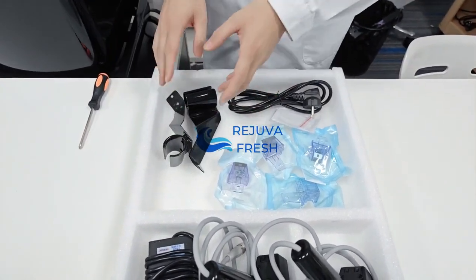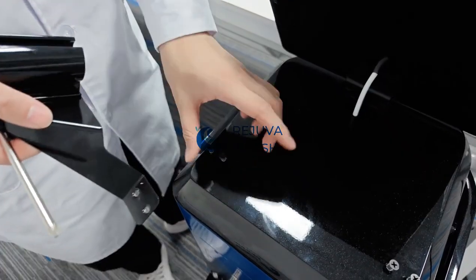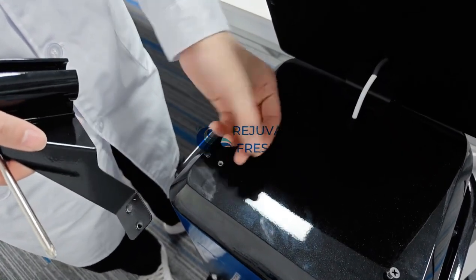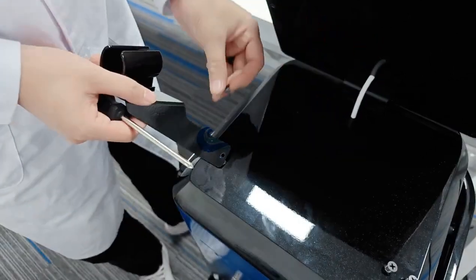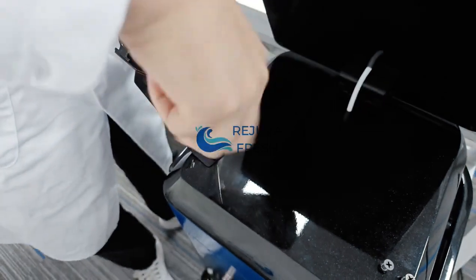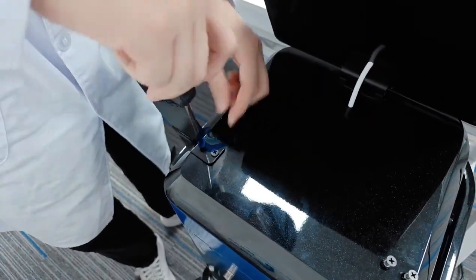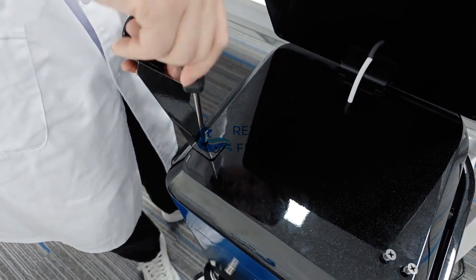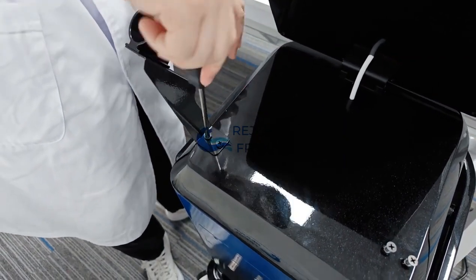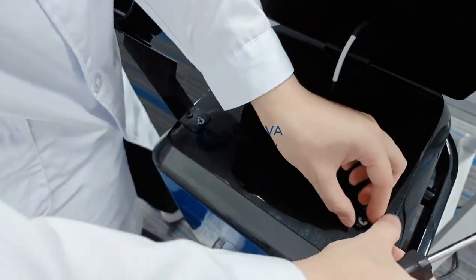Next we are going to connect the holding parts with the main machine. First step: remove the screws on the main machine, then connect the holding part with the main machine, and the other side the same way.